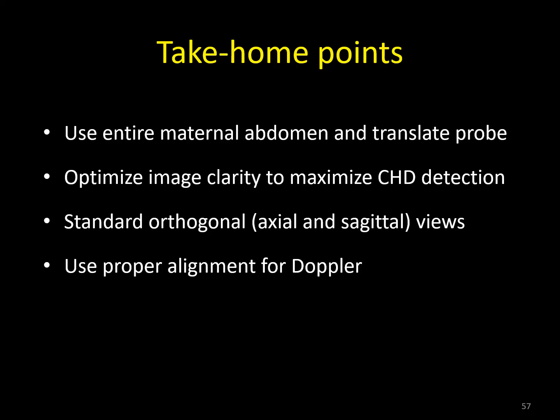Critically important is to optimize your image clarity to maximize the detection of congenital heart disease. Very important, specifically in those cases where you have polyhydramnios or other things that can cause the heart to be difficult to image. You want to maximize as much as you can, narrow the sector, zoom up the heart, and just make things as clear as possible using the highest frequency possible, and then dialing it back if necessary.